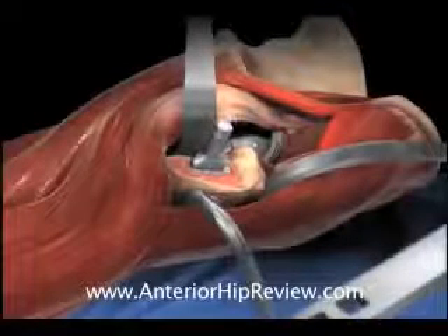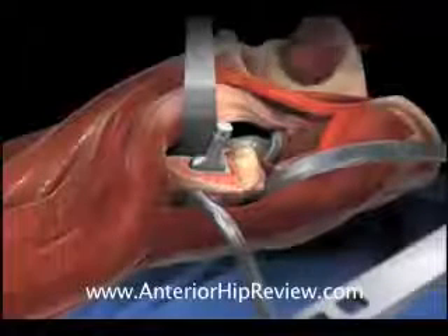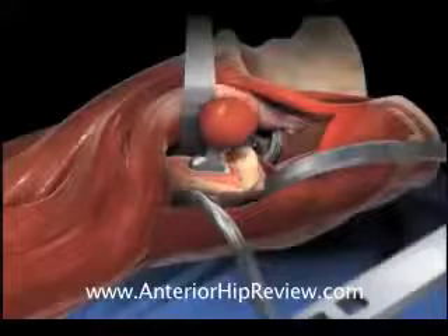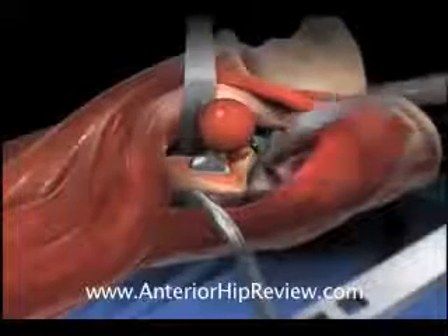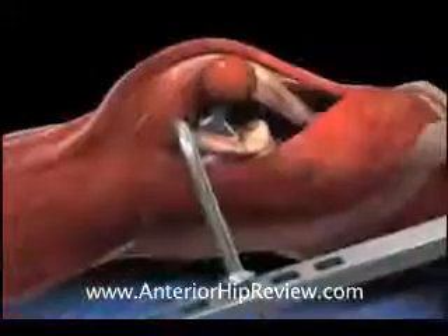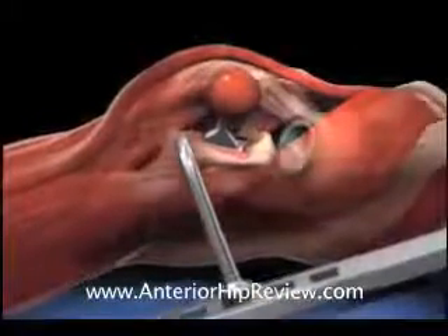At this stage of the operation, when using the direct anterior minimally invasive approach, it is also possible to examine the hip under fluoroscopy to make sure that the limb lengths are appropriately reconstructed and that the fit of the components within the anatomic landmarks of the acetabulum and the femur is appropriate.